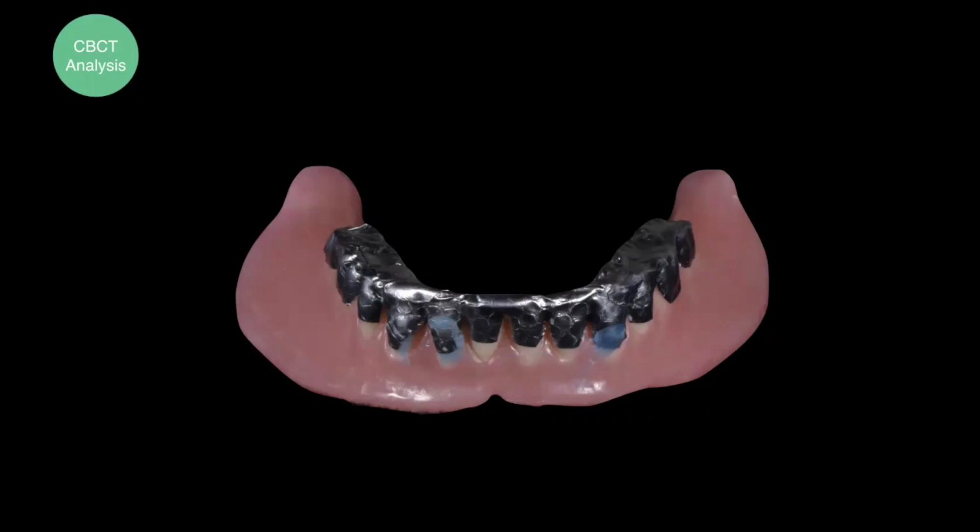I learned it from Dr. Goodacre, and it's a very fast and efficient way to do it. All those old films have lead foils, and you can secure them on the existing dentures, if they are well made, or if you think they are okay regarding the teeth position or the vertical dimension. In many cases they might be worn down, but it's fine. Then you adapt them to the teeth and secure them with some wax.